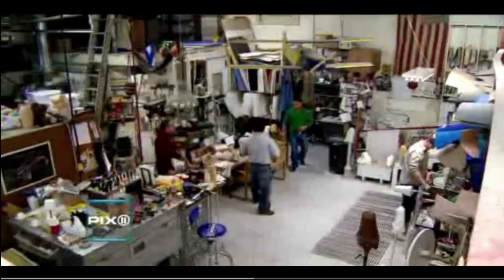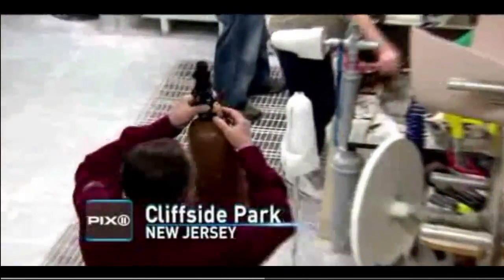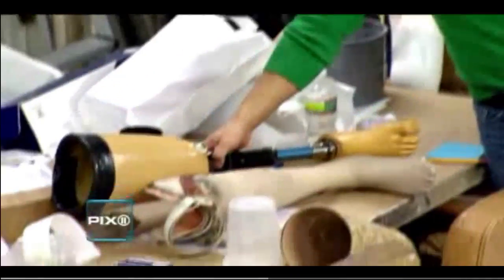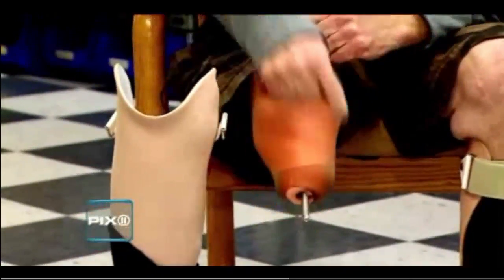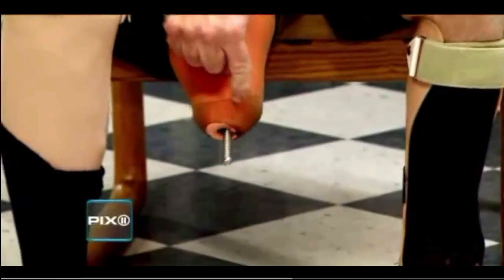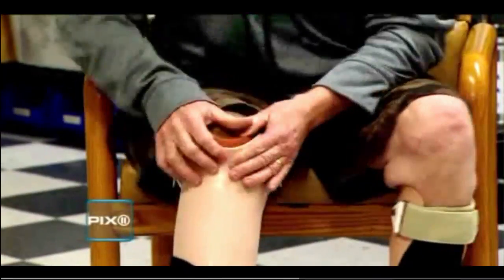Right now we have a piece of material in the oven. Valenti's 12,000 square foot lab features artificial limbs from generations past. He prides himself on the flexibility of his modern devices made from materials like plastics and titanium. You and your leg today become almost one. When John Foley lost his right leg nearly 44 years ago as a teen soldier, the original prosthesis felt like a cement cast, he says, with a strap. The new technology today is a lock mechanism that when you put your stump in, it locks it in.